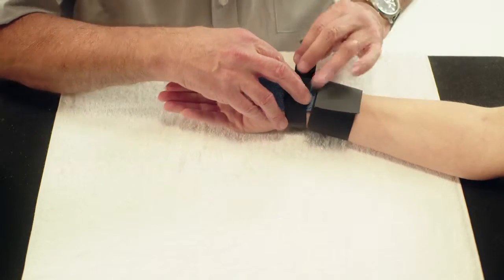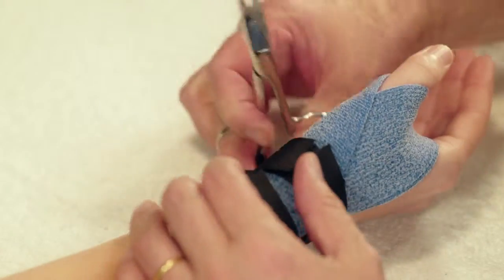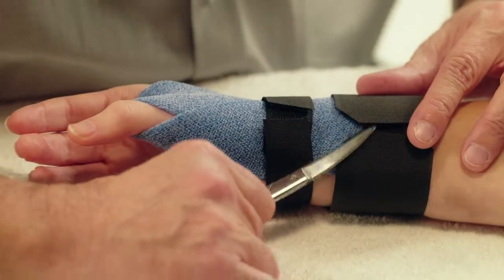A second strap of Velcro loop can be attached around the wrist. Cut away any excess Velcro loop and round the corners.